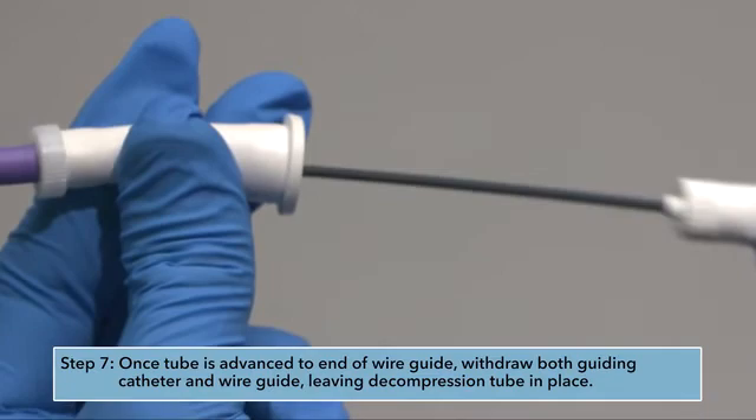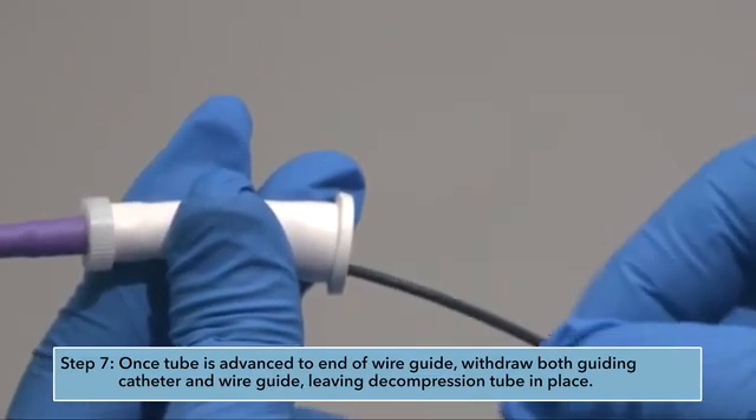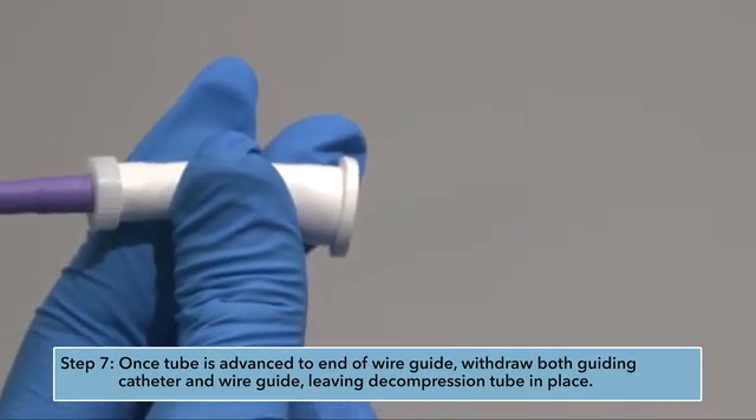Step 7: Once the tube is advanced to the end of the wire guide, withdraw both the guiding catheter and wire guide, leaving the decompression tube in place.